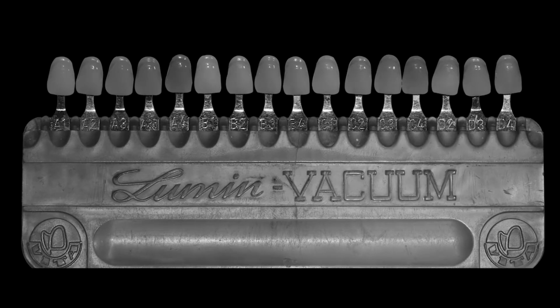Now let's go back to the Vita Classical Shade Guide. Now if you notice here that there is no rhyme or reason to the colors here. If you look at the very far left, which is an A1, look at the brightness. Does it look brighter than A2 that's next door to the right of it? It should.